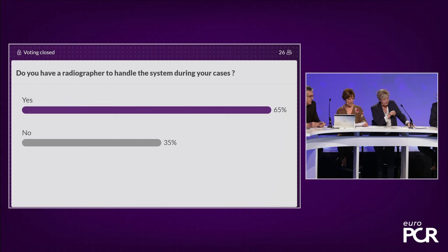So perhaps, Tom, how do you optimize doses during angiography? Do you take care of the dose? Yeah, we've paid particular attention to this recently. It's become apparent in terms of wearing of lead and protecting the patient in prolonged procedures. It is a balance between our radiographer and ourselves in the cath lab to achieve optimal imaging. In long cases, we will be told we need to be mindful of staying in one position for any length of time. In our most recent labs, we've started to have RaySafe available, which gives an immediate visual cue as to whether we're exposing ourselves too much to the radiation. And then the radiographer is monitoring the dose to the patient and informing us as we step closer to a point we need to stop.